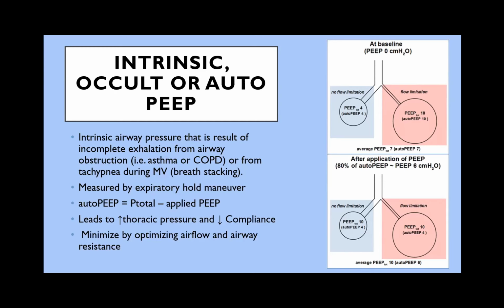And how long would that usually take? Usually, unfortunately, it takes almost a minute for it to completely happen. So it's not a good maneuver to do when the patient is severely hypoxic in this setting. And it's always a maneuver that you have to do with some supervision. But you're going to see it at least once during your residency that with many of these asthma and COPD patients, we end up literally applying a lot of pressure on their thoracic cavity to allow the air to be exhaled. And this happens because the vent was not adequately set up or the patient was not adequately sedated for the level of airway disease that they had.